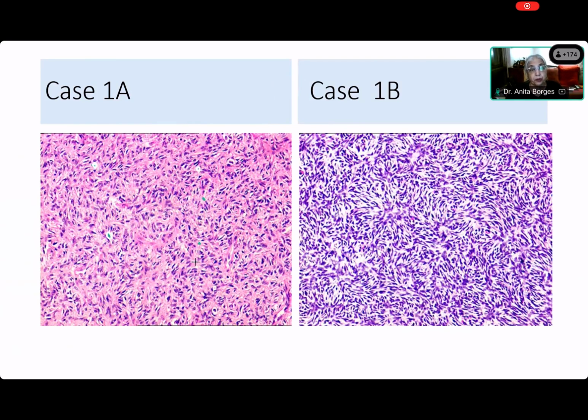If anybody has a problem, you better tell me now, because this is absolutely storiform. Saida, you have a problem? No, ma'am. Are you sure? Because you've seen this case before and you were not able to say it was storiform. You said it was haphazard. It is not haphazard. Here are all these central points from which these things are radiating out. And here you can see this. This was exactly the same case that I showed you before. Does anybody have a problem?